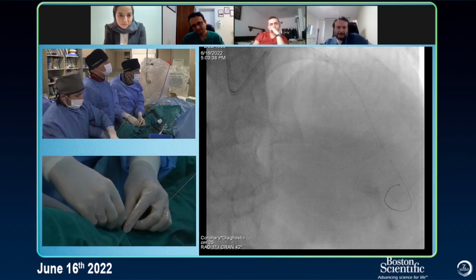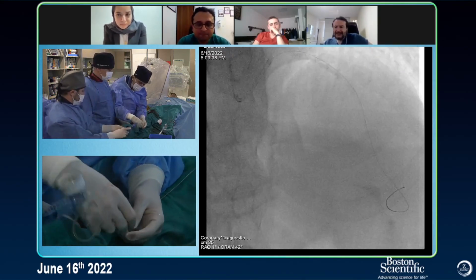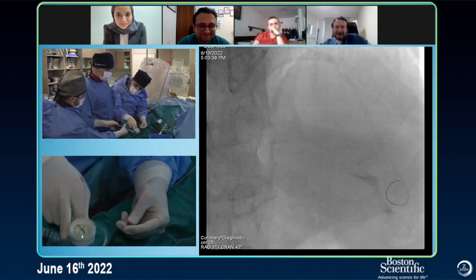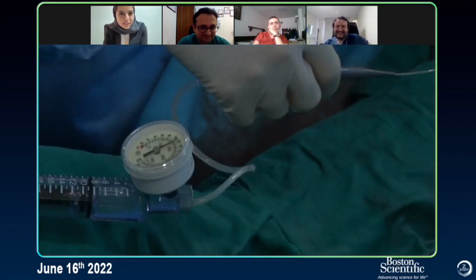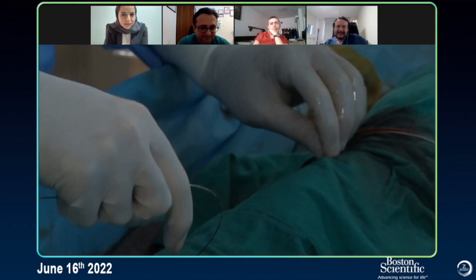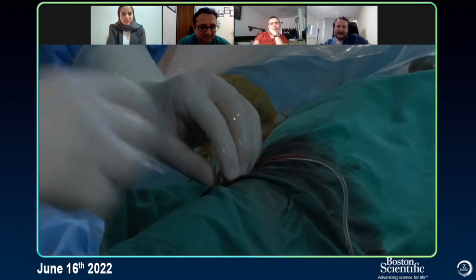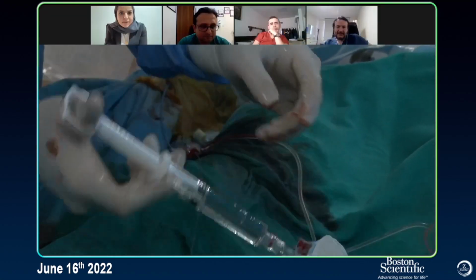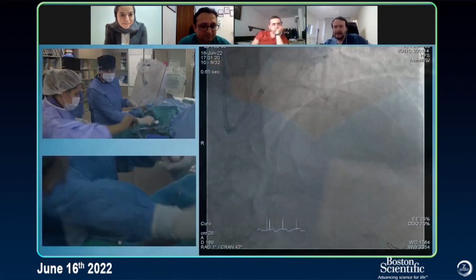What do you think? I think it's time to rewire it. I would protect it. It will be very exciting to see how you wire that diagonal. Are you using an NC balloon now? No, we are removing the Mamba catheter, and I like to have another wire of choice, please, for the side branch, and we will keep it open for the first diagonal too.